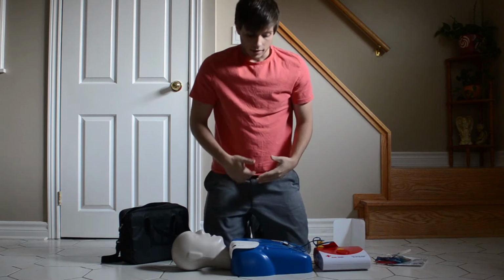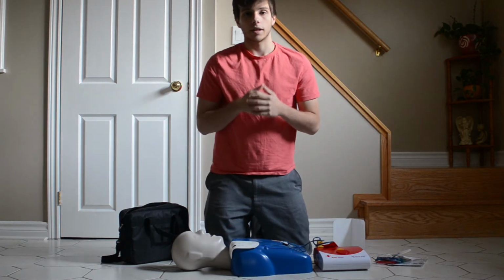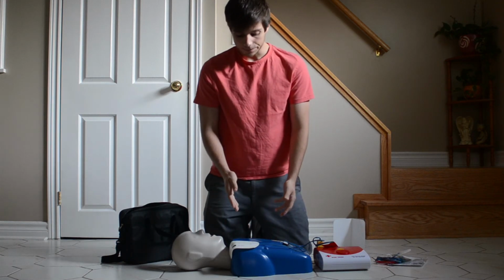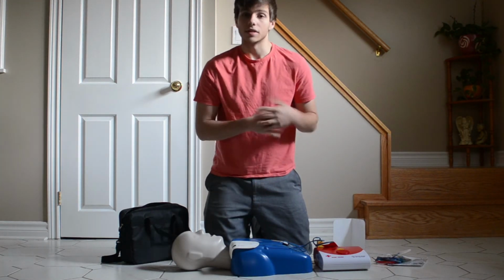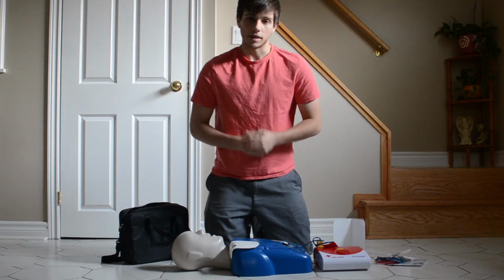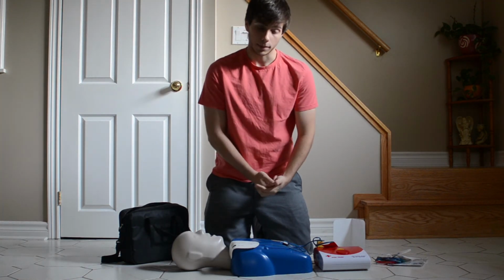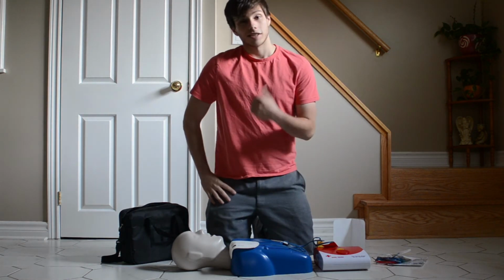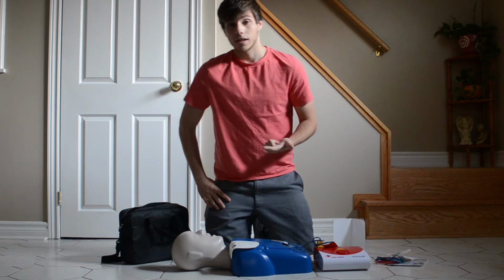As you're doing this, you want to make sure CPR is happening as much and as fast as it can. You're going to keep doing CPR until this thing instructs you not to. When it says, analyzing, please step back from patient, this is where it's going to read the heart rhythm. So you're going to step back, make sure no one's touching him, and let it read. After that, it's either going to say shock advised or shock not advised.